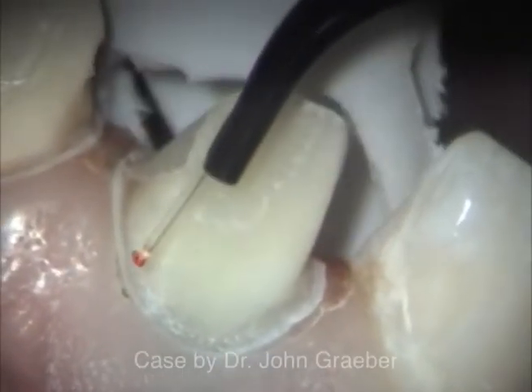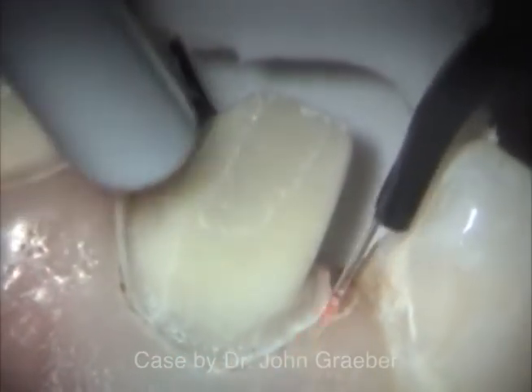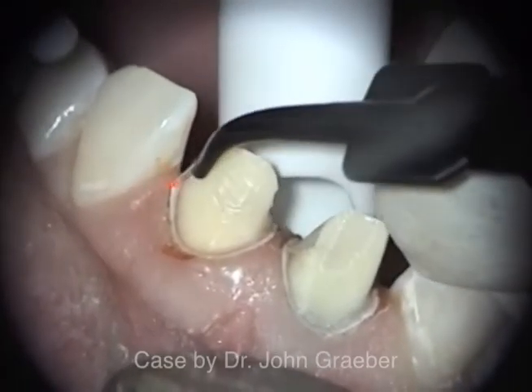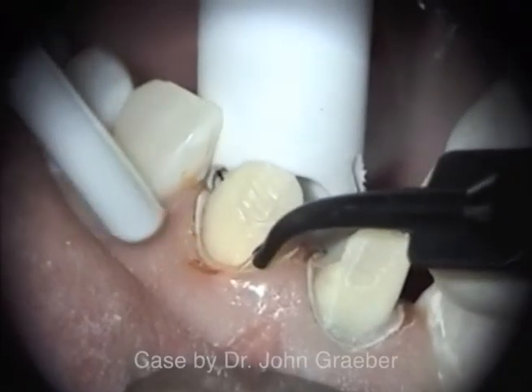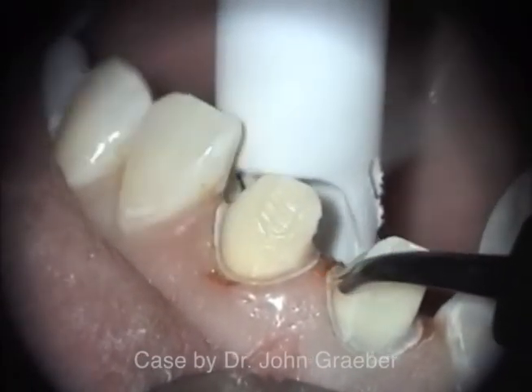A 400 micron wide fiber is capable of ablating a trough of approximately a half a millimeter wide. It would take about three passes of the fiber to create a space about a half a millimeter deep, which is an ideal space for impression material.